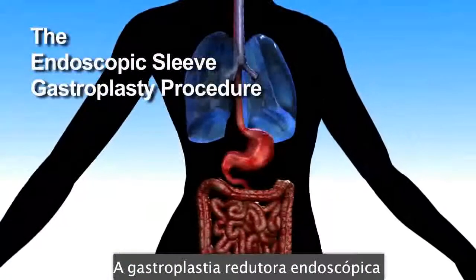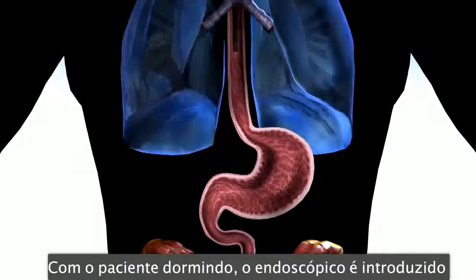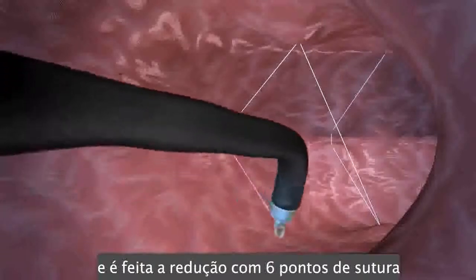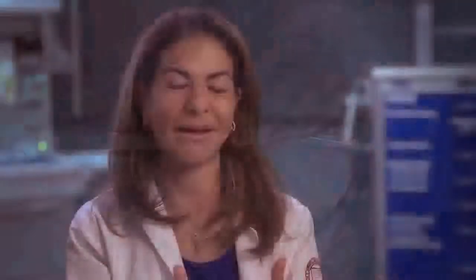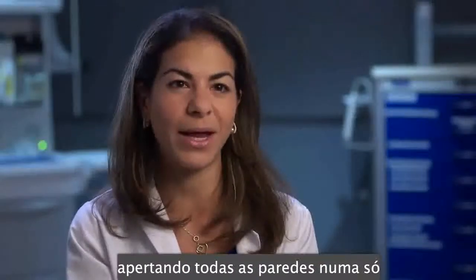The endoscopic sleeve gastroplasty procedure constricts the stomach without any surgery. The patient is asleep, the endoscope is advanced through the esophagus into the stomach. You perform the sleeve by doing a set of six sutures and then you bring the sutures together by tightening it — similar to an accordion being closed down. That's what the stomach does; you bring everything together and that closes down the stomach quite nicely.